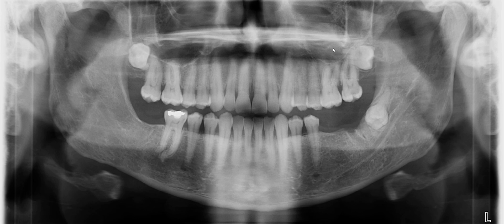If you look at number 16, we can see that the crown is facing distally, and we can roughly make out the roots of number 16, which in fact are superimposed with the roots of number 15.